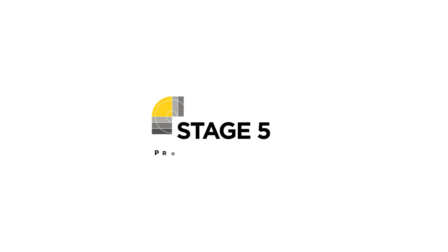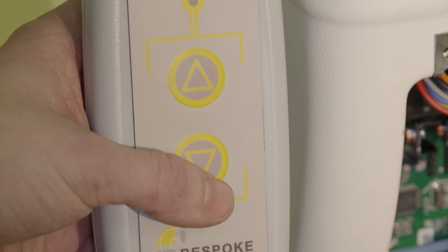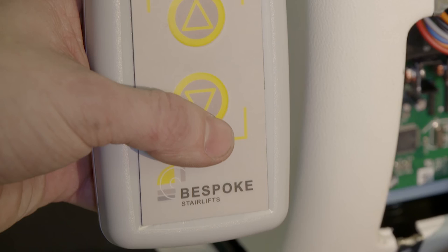Stage 5: Programming the remote. The next steps must be followed precisely and carefully to ensure the remote is properly programmed and linked to the stairlift.